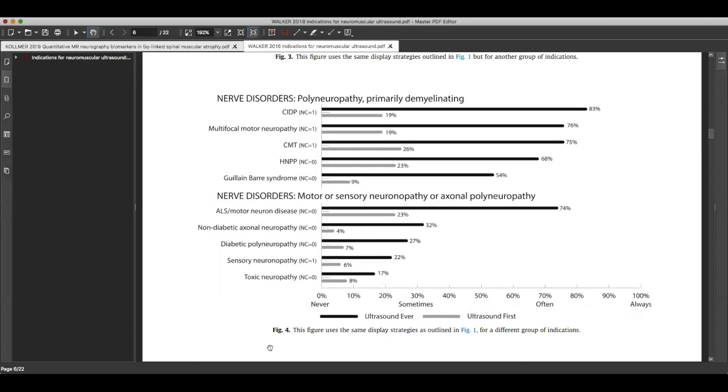I didn't talk, of course, about nerve ultrasound. Nerve ultrasound has huge advantages also, and is a quite available technique where we can have it on bedside. It is also in the hands of neurologists, and we can assess with similar and even higher detail the peripheral nerves.